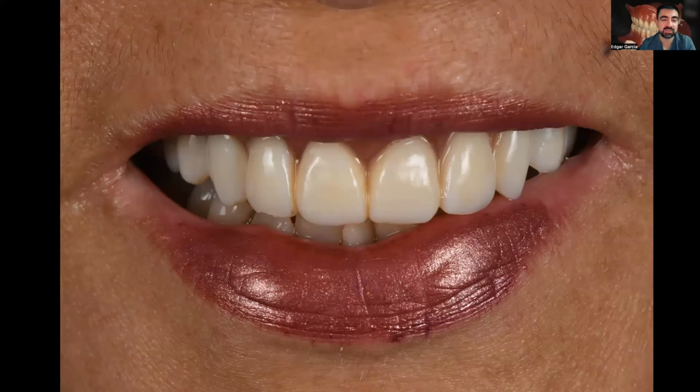But it's not the same as when I do the lower cases. As I told you since we started this, the alginate impression in the lower ones is for me the most important part of the technique. I think this is just a super summarized part of all the protocol that we have nowadays. Complete dentures for me today are more fun than the way that we used to do it.